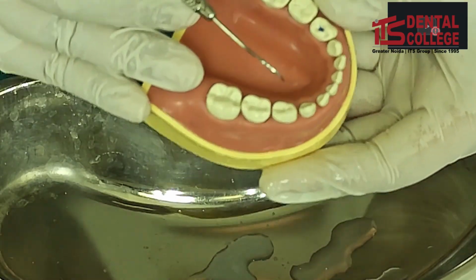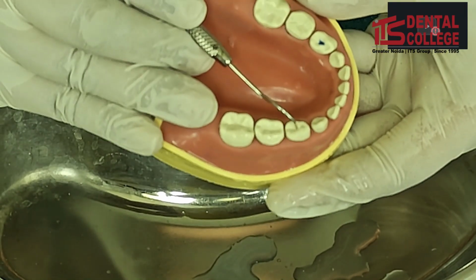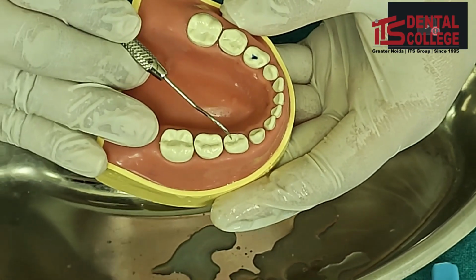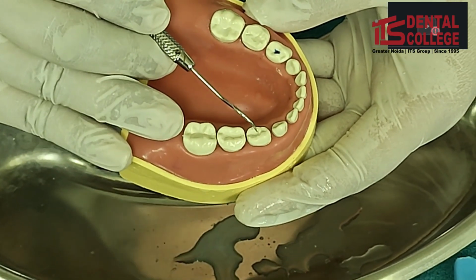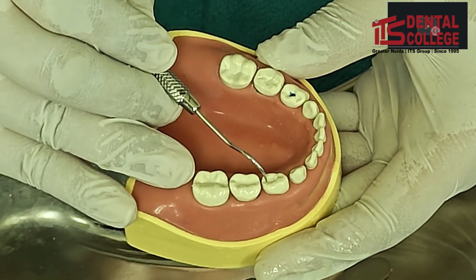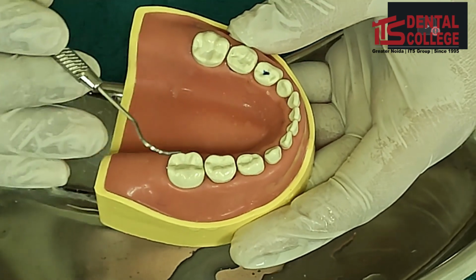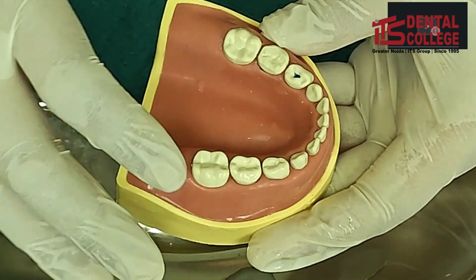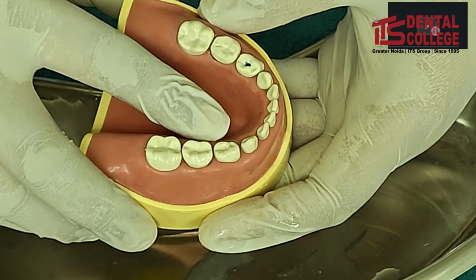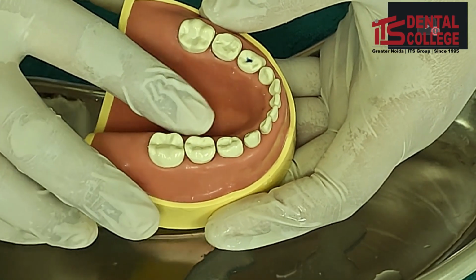So now you can appreciate that a conservative cavity has been prepared for filling it with glass ionomer restorative cement. All the carious tooth structure has been removed. If in case any additional carious tooth structure remains, then we may use a spoon excavator to remove it from the deeper depth of the cavity.